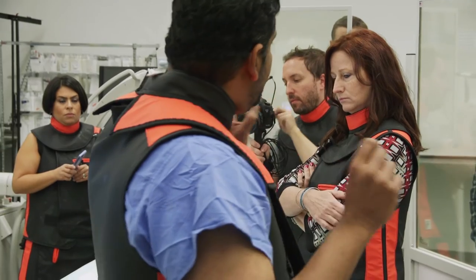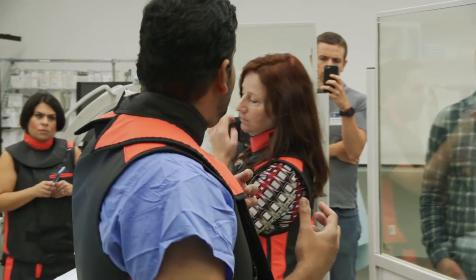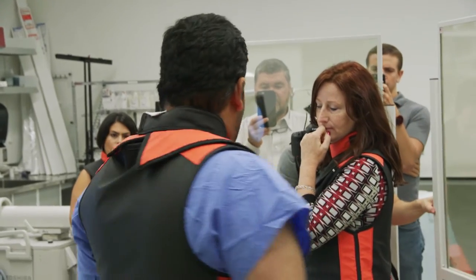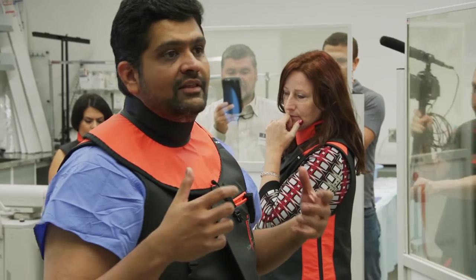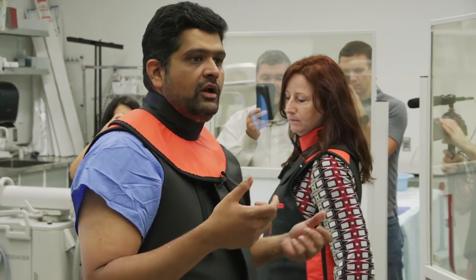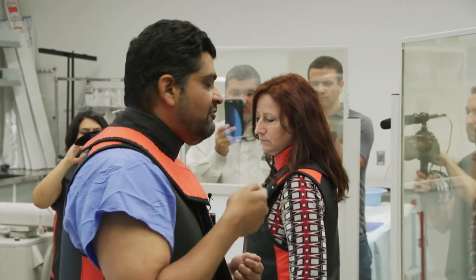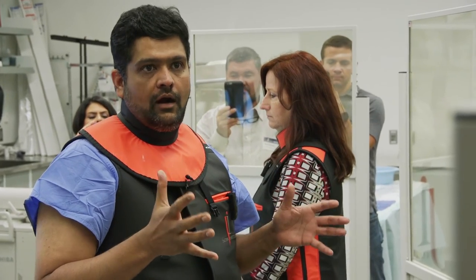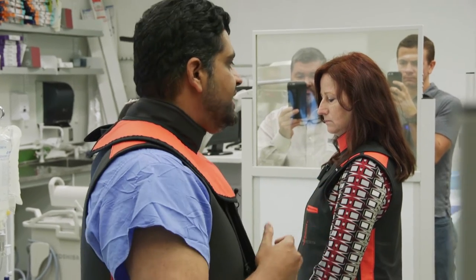You can tailor your tissue because you get multi-material printing. For example, in the mitral valve, the mitral annulus is often calcified — very, very hard. So you're trying to deliver a device that may be easy to deliver in a normal heart, but you're not dealing with a normal heart. They were able to create for us a calcified heart material model, so we could go ahead and deliver a valve and see how it sits in that abnormal, pathological heart. It really helped in deciding how to approach the whole case.